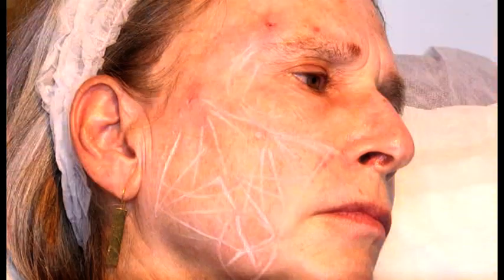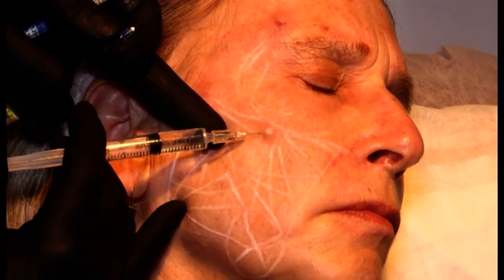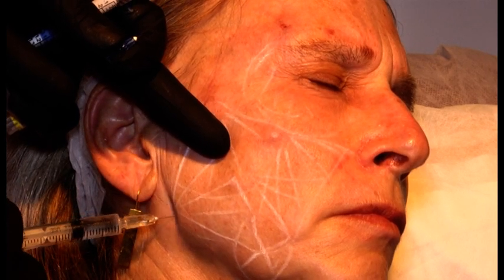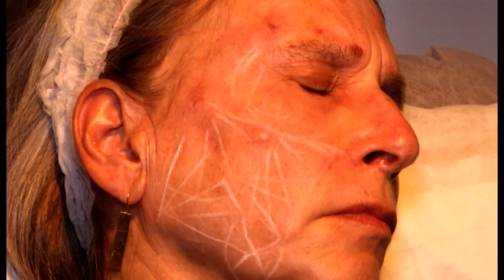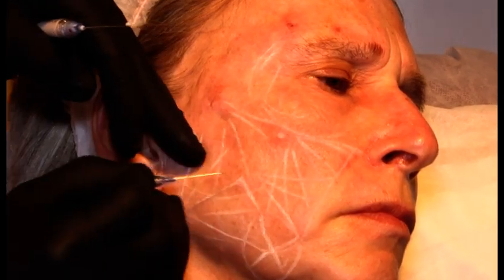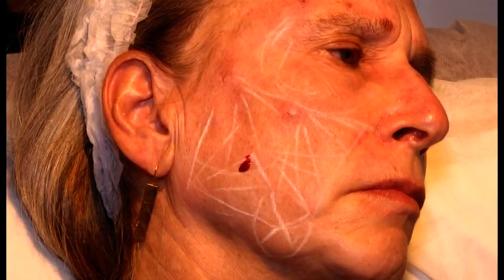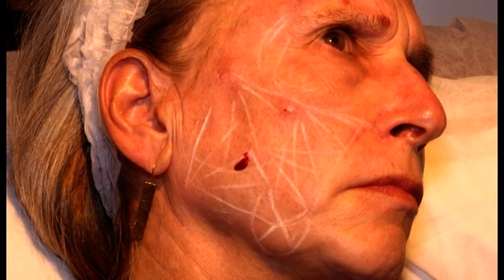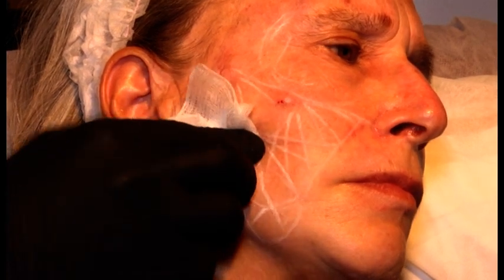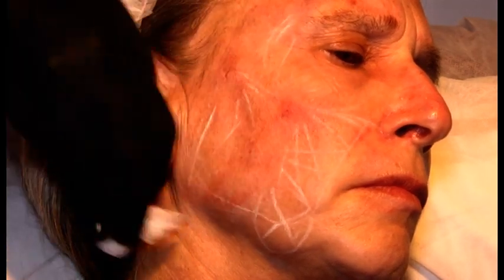I gave her some anesthesia previously, so might as well do it again. 1, 2, 3. 1, 2, 3. And 1, 2, 3. So I will start over here. 1, 2, and 3. Dry gauze, please. Thank you. Okay. Second entry point.